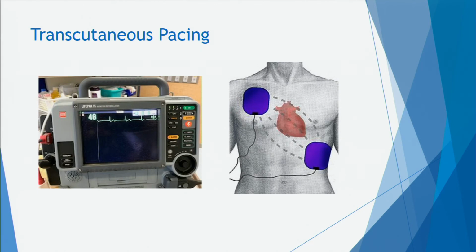I think it says every 24 hours after 50 defibrillations, which sounds like, hopefully they're still alive. We shocked them 50 times, let's hope they're still alive. But the gel will wear out on them and you won't get a good connection. I've only actually had to pace someone with a crash cart twice, ever. And I had to press so hard to actually get capture to achieve what we wanted.